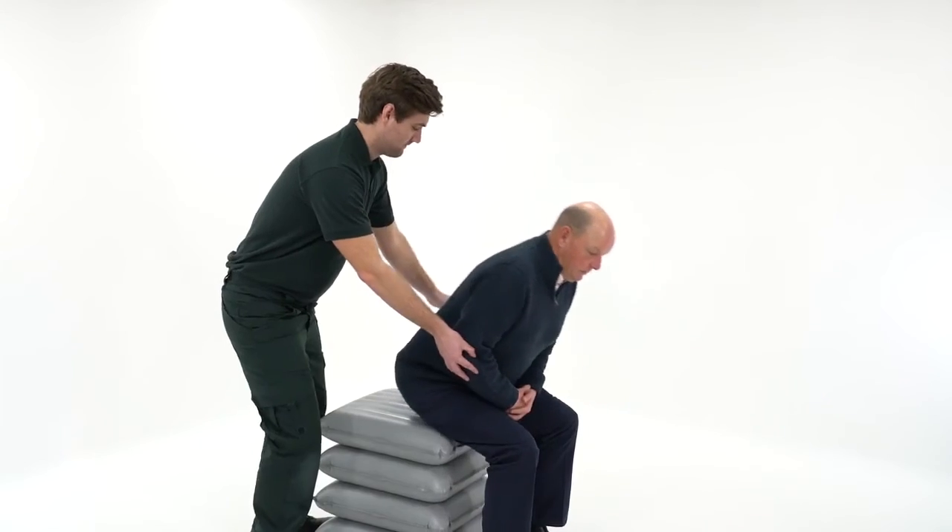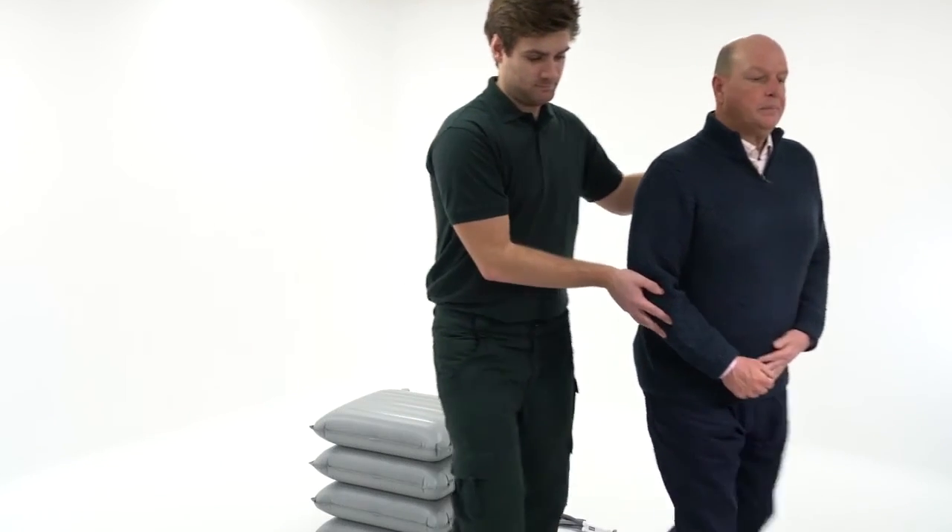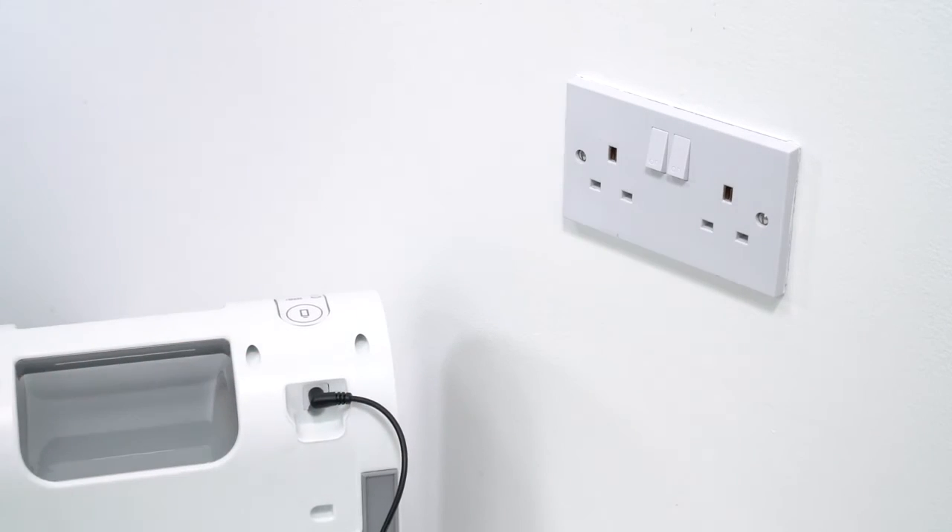Once the required number of sections have been inflated, the paramedic can help the person stand up or transfer. The airflow should always be put back on charge as soon as possible.